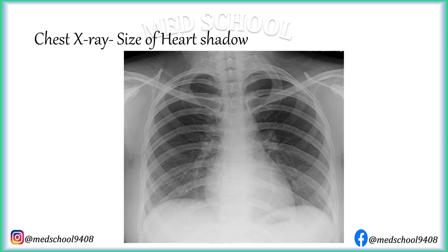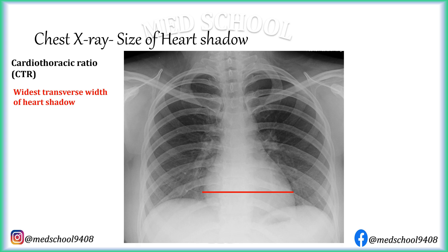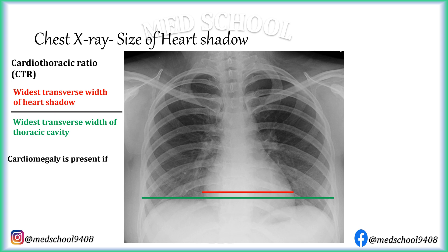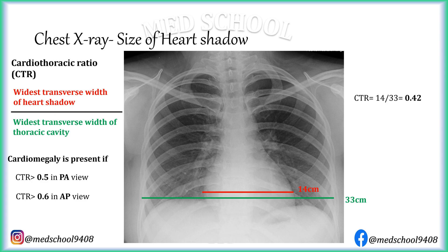The size of the heart shadow can be enlarged in cardiomegaly. To confirm the presence of cardiomegaly, the cardiothoracic ratio is used. The cardiothoracic ratio, or CTR, is calculated as the widest transverse width of the heart shadow divided by the widest transverse width of the thoracic cavity. Cardiomegaly is said to be present if CTR is more than 0.5 on PA view and more than 0.6 on AP view. For example, if the widest transverse width of the heart shadow is 14 cm and the widest transverse width of the thoracic cavity is 33 cm, the CTR would be 0.42 — so cardiomegaly is not present in that X-ray.